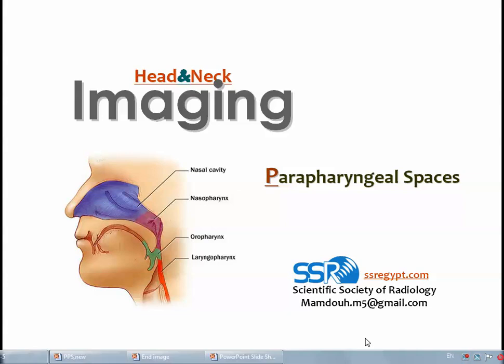Dear colleagues, we are still handling the sector of head and neck imaging. We have finished the anatomy and pathology of the petrous bone, and we have also discussed the anatomy and pathology of the paranasal sinuses. And here we are handling an important topic, which is an intermediate zone between so many anatomic locations in the head and neck, which is known as the parapharyngeal space.